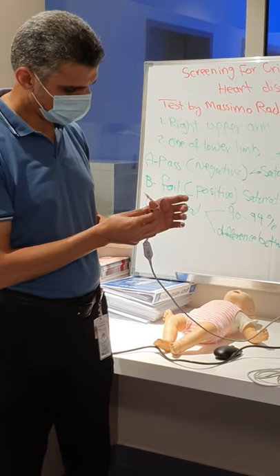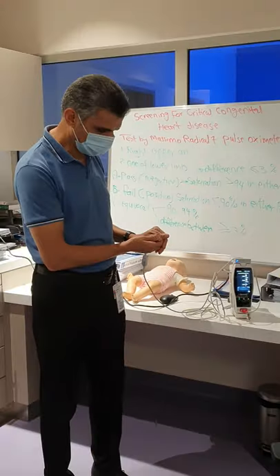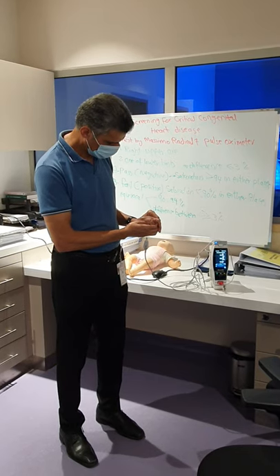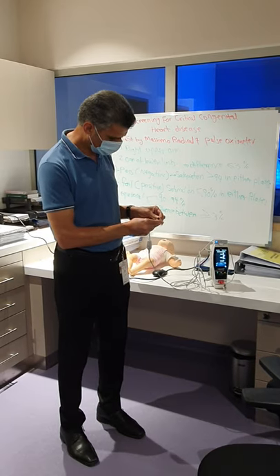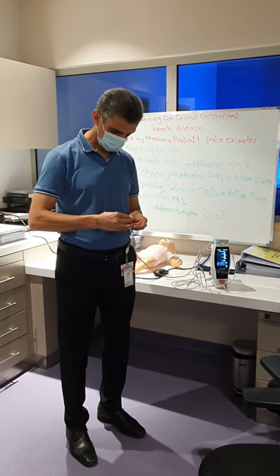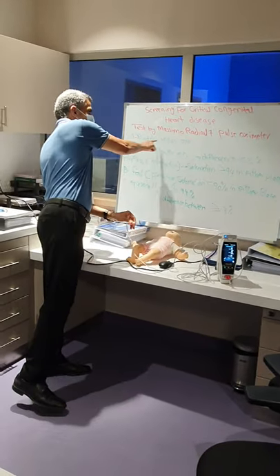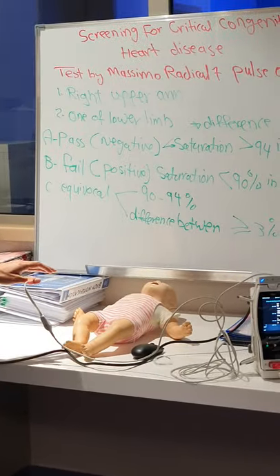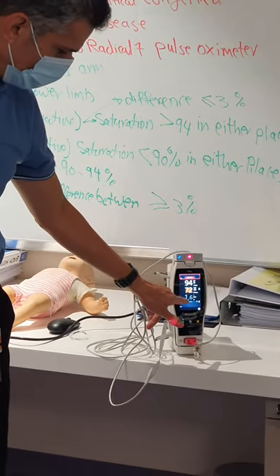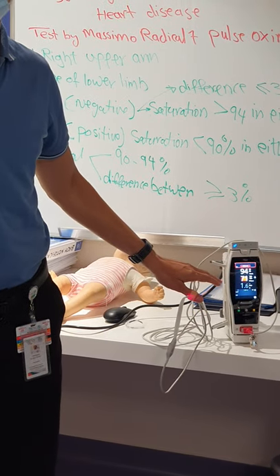If you put it on right away, it takes a moment and starts recording. Usually it takes time to record — I am not ripping it off yet. After you rip it off, it comes up like this. You can see the saturation, the heart rate, and also the perfusion index. Usually it takes time to record, and when the number first appears it might not be the real value — it needs time to stabilize.